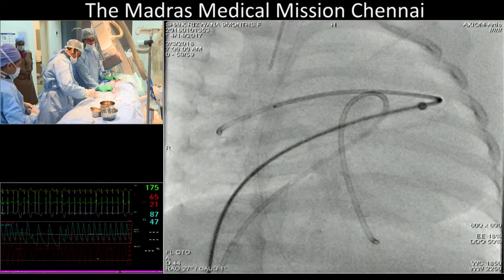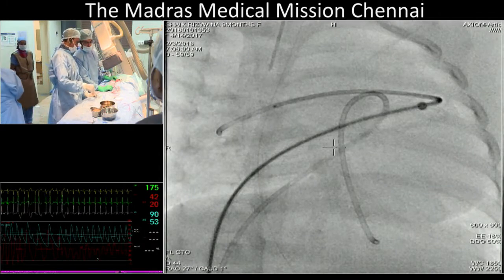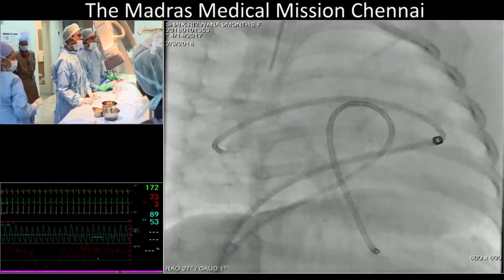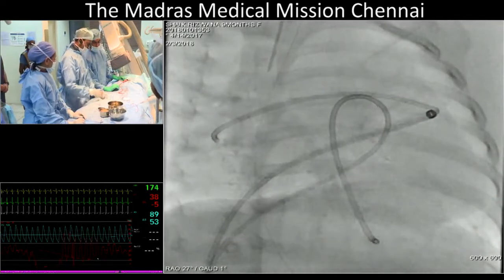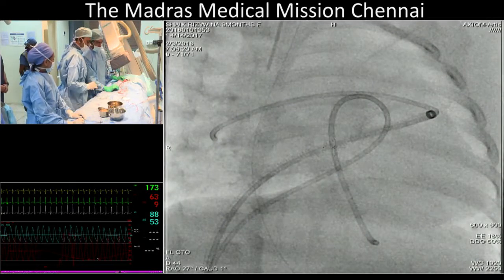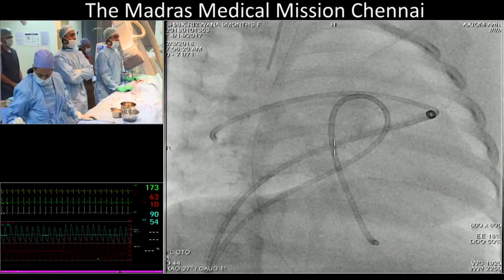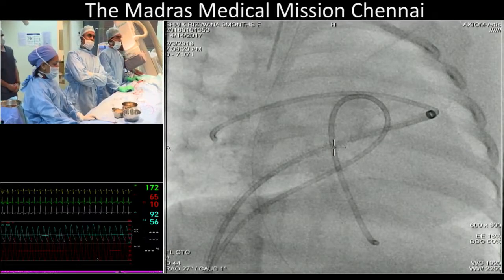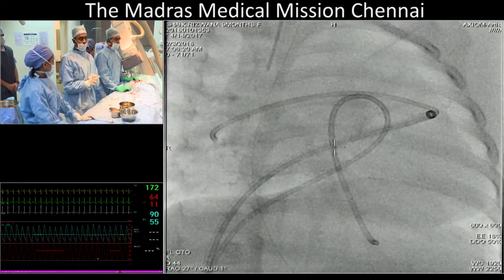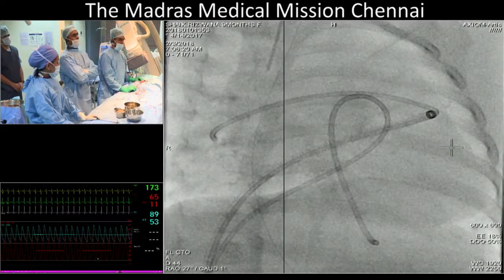Anybody in the audience would stent now? Anybody? Okay. All right. So Shiva, what presumably you're trying to show is after the Mustang balloon, you've got a dissection flap on the inferior aspect of that right pulmonary artery. I heard Zahid telling that basically he will do nothing, in general, for a Williams with bilateral pulmonary artery narrowing.